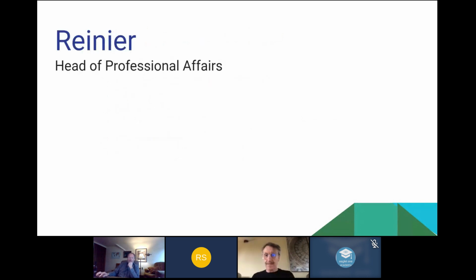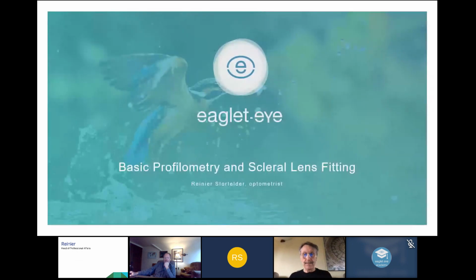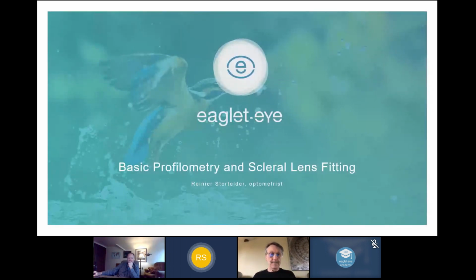So I am going to turn it over to Dr. Stortelder and let him go from there. All right, thank you. Everyone can see my screen now, I hope. So, basic profilometry and scleral lens fitting.